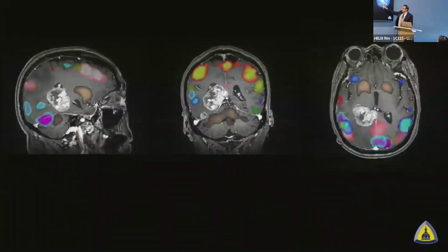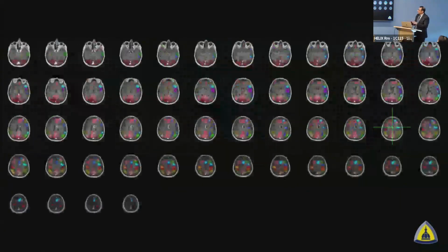I'm not saying that this part of the brain is not important, but I'm saying that we don't really know what that part of the brain is doing, but I do know that this is default mode network, right? And this, I remember the blue is language system, and some other visual systems over there, that if we can try to avoid it, let's try to avoid it.